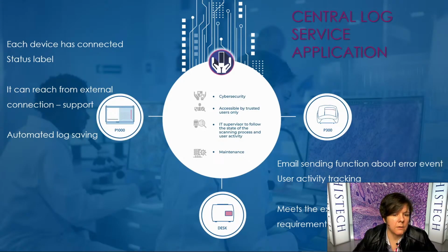Generally, the clinical environment means that the scanners and servers are integrated into the local network. The closed network protects the diagnostic system from viruses. Since our systems are not accessible by external connections, it is difficult to know if an error event has occurred. The email sending process doesn't work due to the closed network.